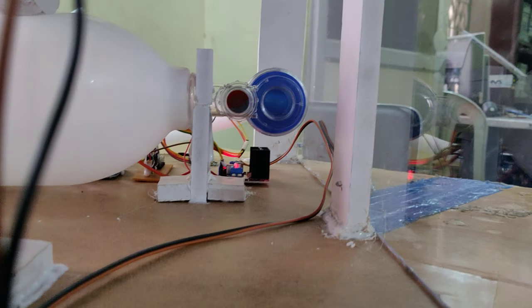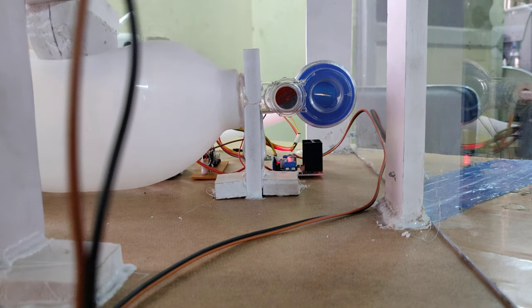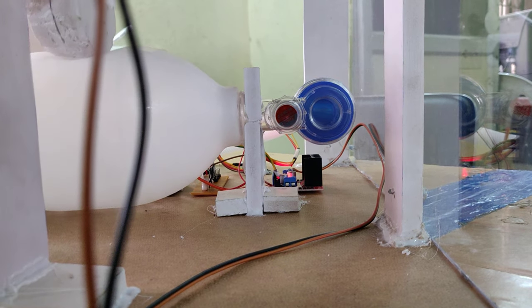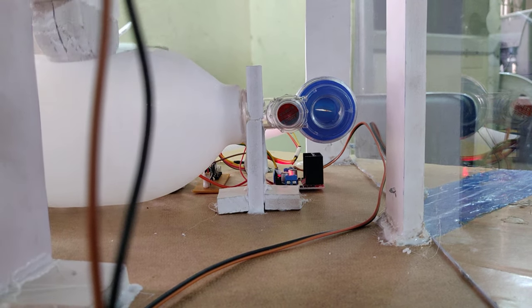Now let us see the diaphragm also. While the air is pumping, we can see the diaphragm. You can see that the blue color is opening the mouth and closing the nose. So when it is pumping the air, you can see the blue color opening and closing the mouth.